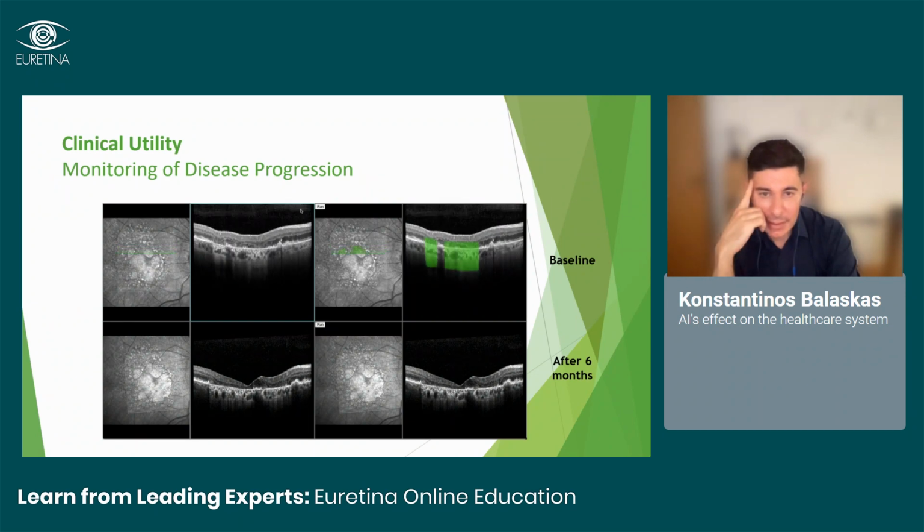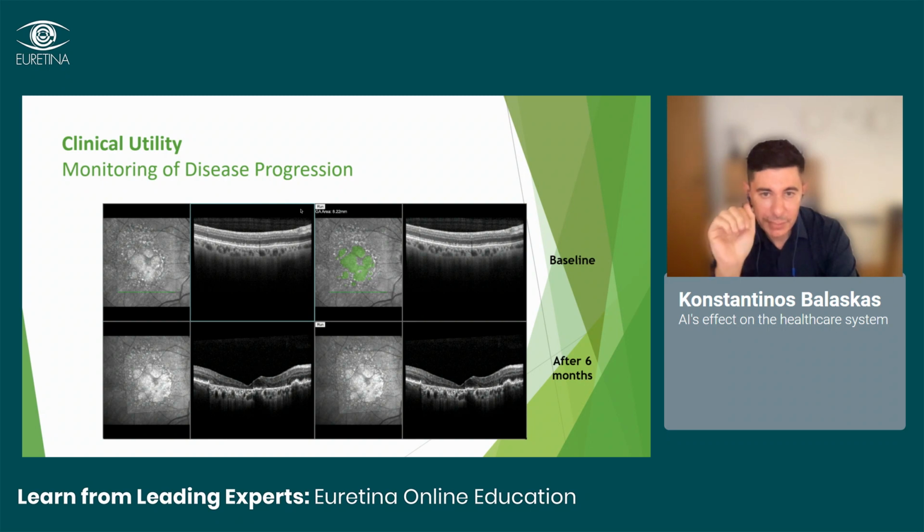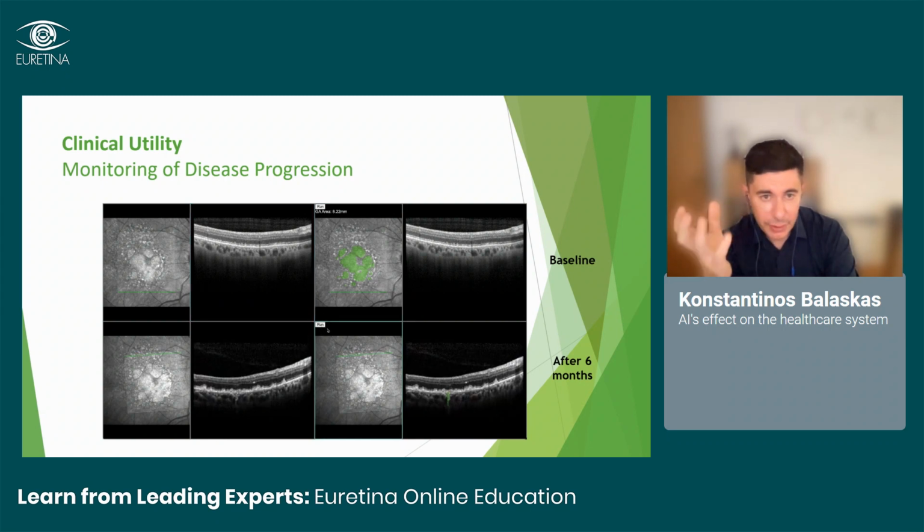let's say there is a case of a patient with geographic atrophy. We apply here the compound model that combines the three constituent features defined by the CAM consensus, and it highlights the area of atrophy. It gives a quantification of how much the area of atrophy is.